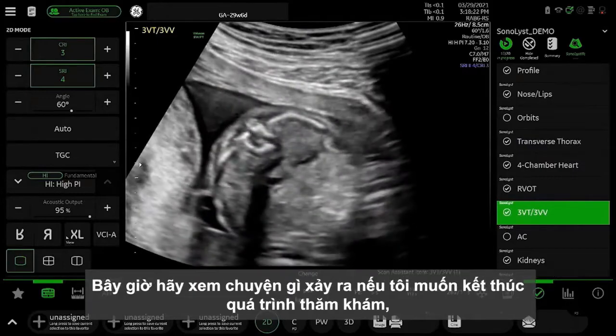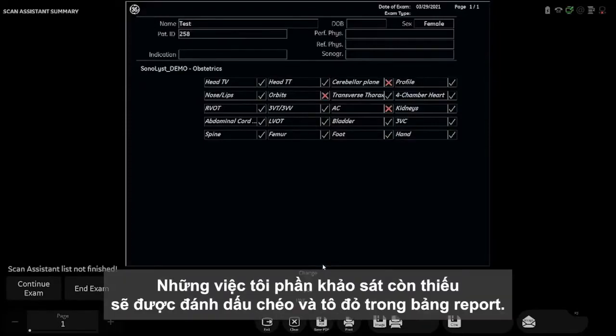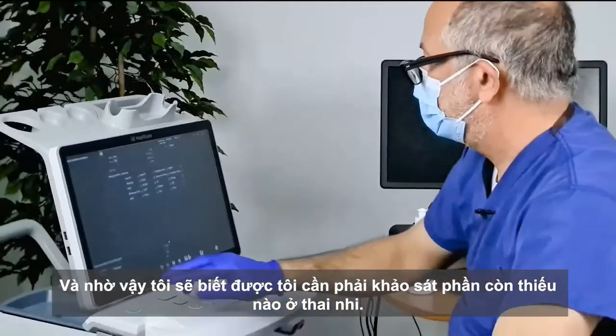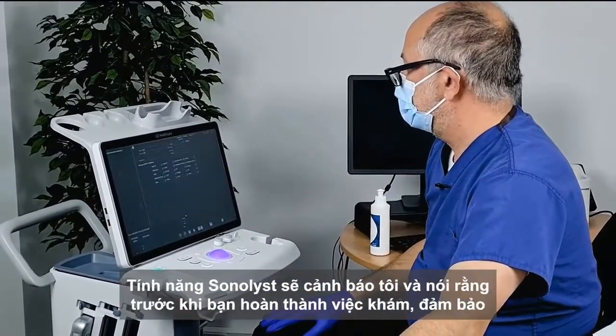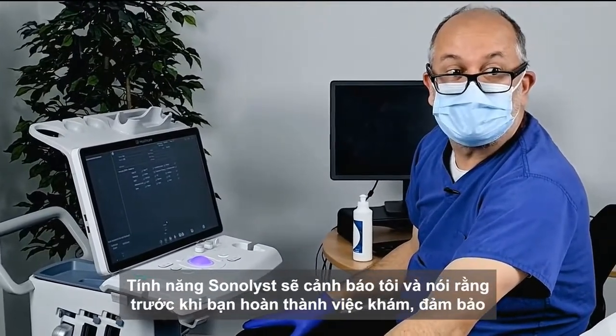Now, see what happens if I try to close this. I can see there the things that I'm still missing, and it gives me little red crosses. So if I'm not sure exactly where I'm at, then I can continue the exam. If I tell the machine to end the exam, it will actually warn me and say, hold on, before you finish the exam, make sure you've got everything.